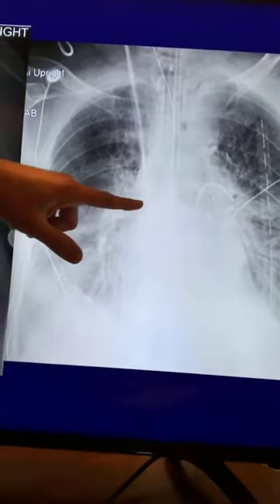This actually has another catheter right here, so there's two lines going into that IJ. So yes, two lines can go into the same IJ. Yes, you can do that. Yes, be careful when you're doing it. I've placed two large bore dialysis catheters into the same IJ. You can do it, you just have to be careful with it, all right? For anybody who's wondering, a Swan-Ganz catheter can go through a sheath, all right? You place the sheath, a Cordis sheath. That's the main one they like using on the floors. You can place a Cordis sheath into the IJ.